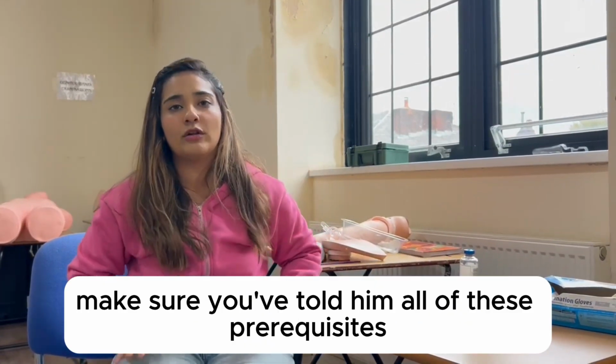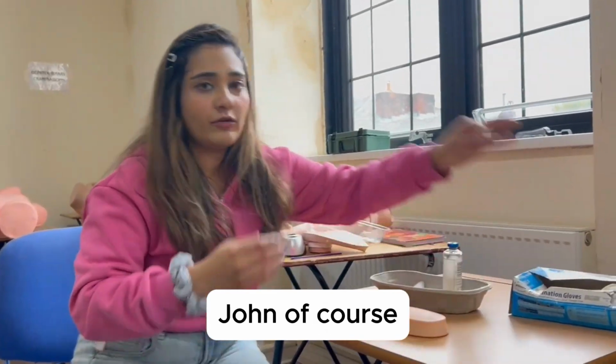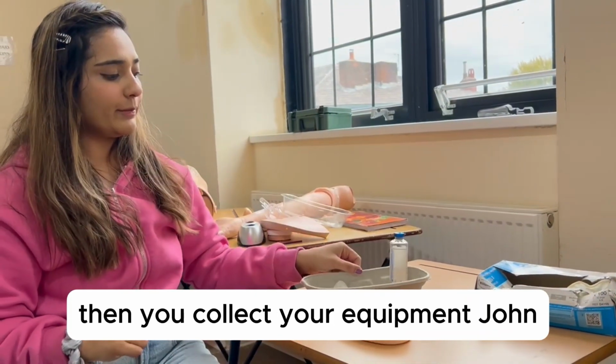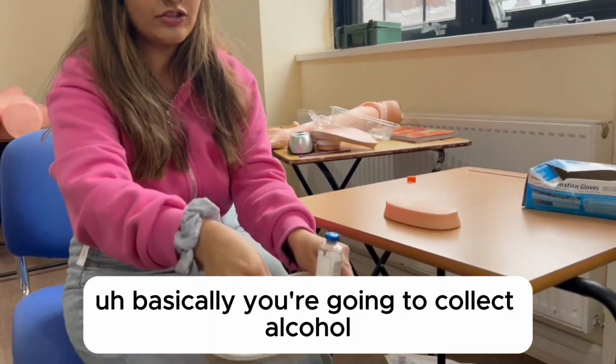Make sure you've told him all of these prerequisites, and then you proceed to tell him what to do. Firstly, John, of course, you're going to wear your gloves. So assume I have gloved. Okay, then you collect your equipment, John. So here is the equipment. Basically, you're going to collect the alcohol swab and a gauze.